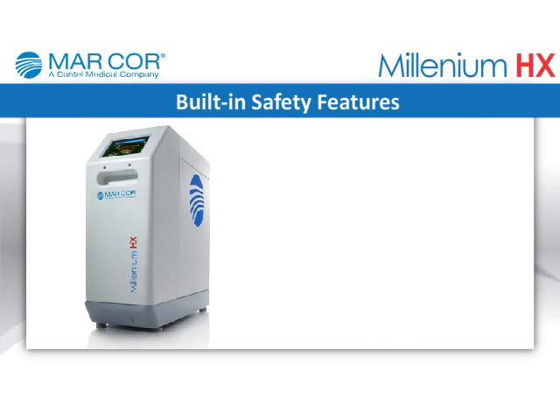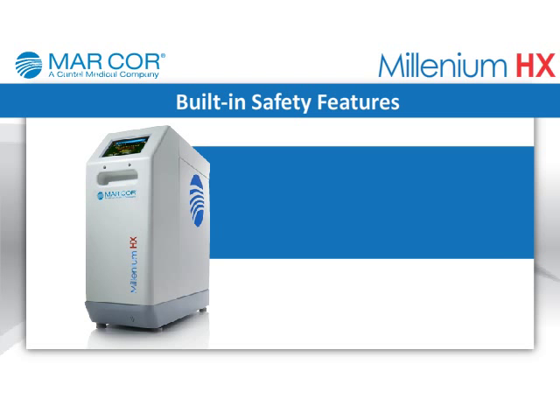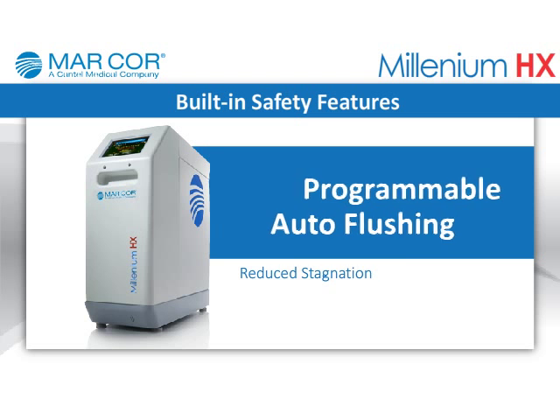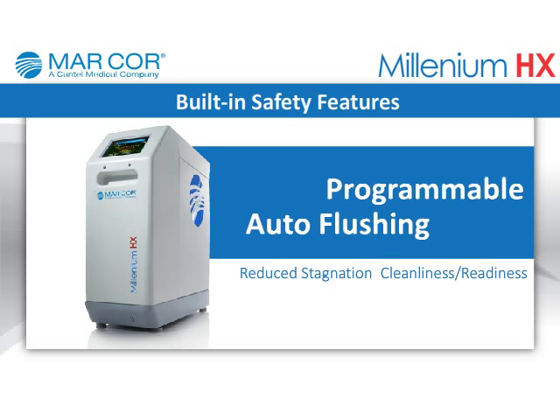Built-in safety features: Programmable auto-flushing and continuous product loop operation reduces stagnation and ensures system cleanliness and readiness when you need it most.